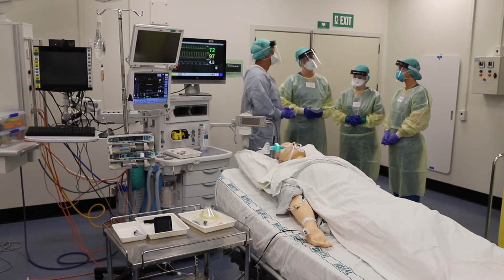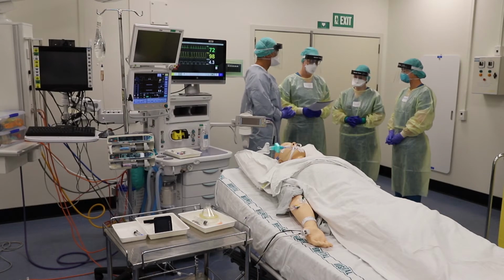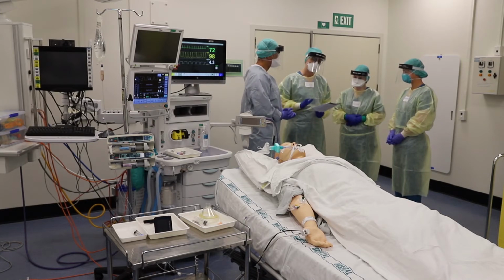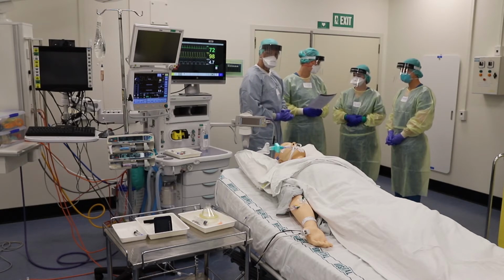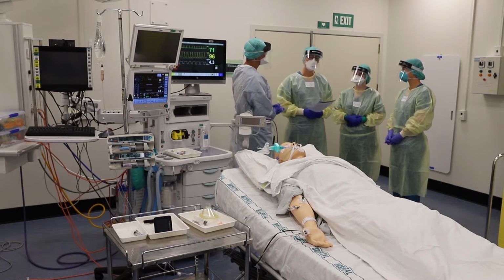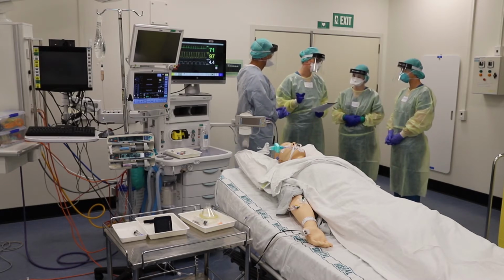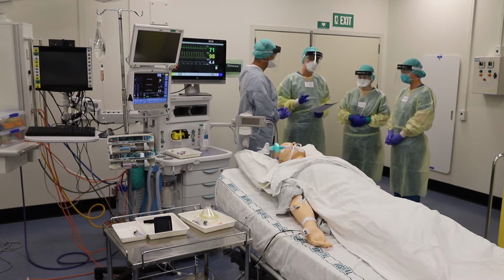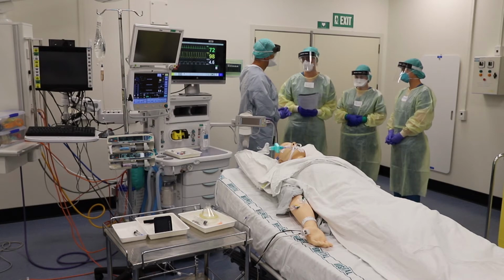So what we want to do is ensure optimal conditions to minimise the chance of any extra aerosolization. So I've already got the head of the bed up, and before we extubate we'll make sure he's well oxygenated. Now let's talk through some contingency plans. In terms of coughing, let's continue the remifentanil infusion, and we have some lidocaine drawn up. So when the time is right, I'll ask you to give 5 mils of lidocaine. Sure.